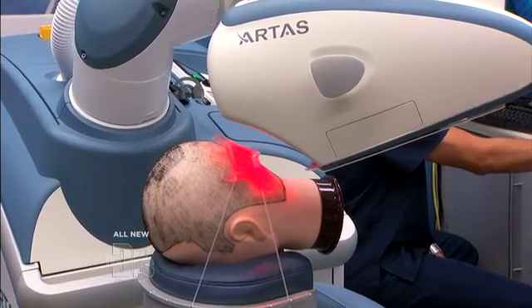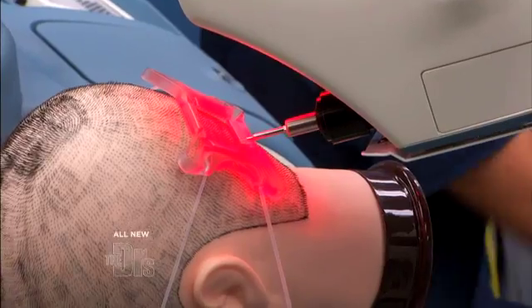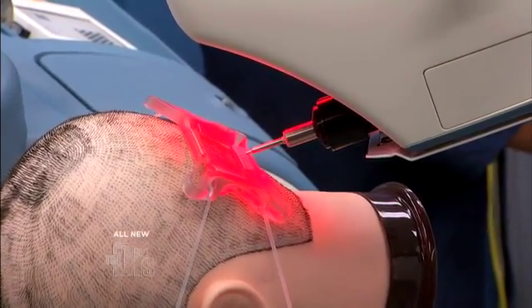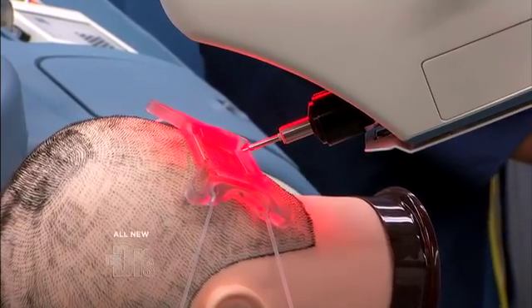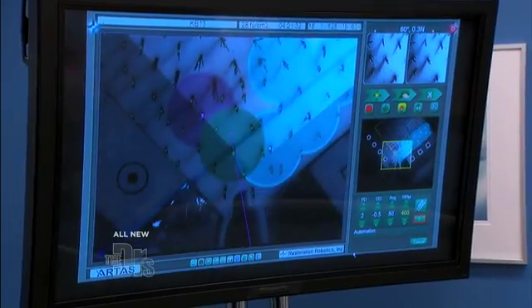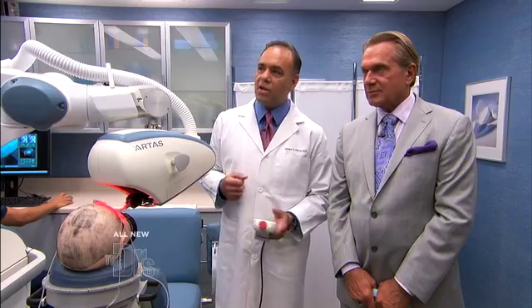Now it's already in position. I'm going to tell it to go ahead and start harvesting hair. This is an example of what the robot does in an actual surgery. Now we're not removing anything right now, but based on our direction it's targeting certain follicles and taking out a certain percentage of hair follicles to leave some behind. It's random, so we're not going to get any weird patterns of extractions. And it's selecting these based on the quality of the hair. We can also tell it we want three hair grafts or two hair grafts.